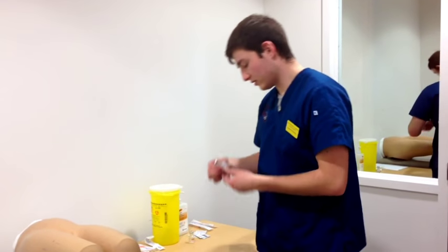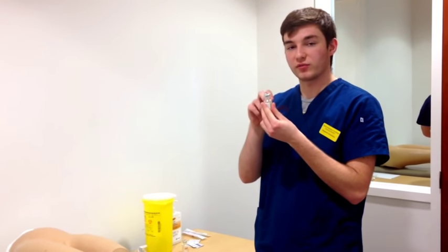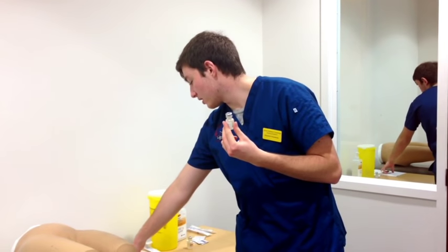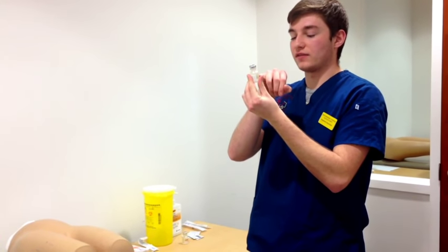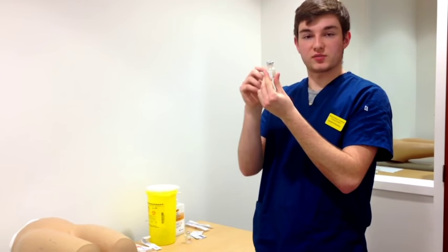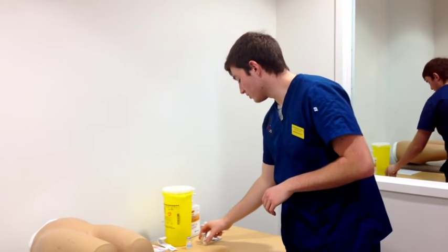Here I have a vial of heparin. We're going to make sure this is the appropriate medication that has been ordered and that we have on hand. The order says heparin, and the supply is 5,000 units per 1 milliliter in the vial. Make sure this is accurate: 5,000 units per 1 milliliter, appropriate. Make sure it's not expired. This is an unopened vial, so all we'll have to do to clean it is use an alcohol swab.